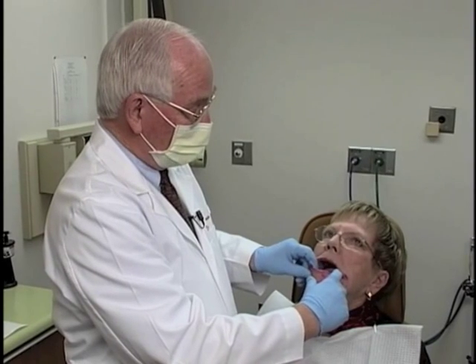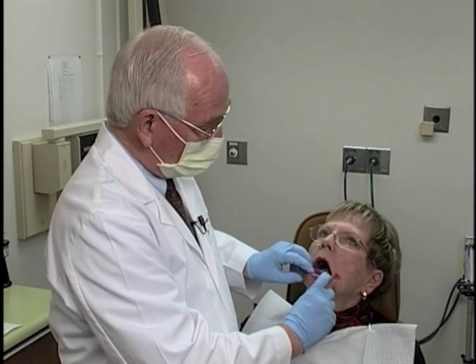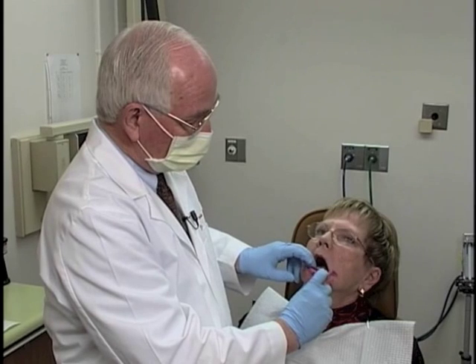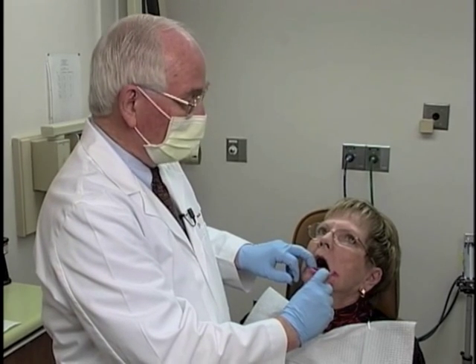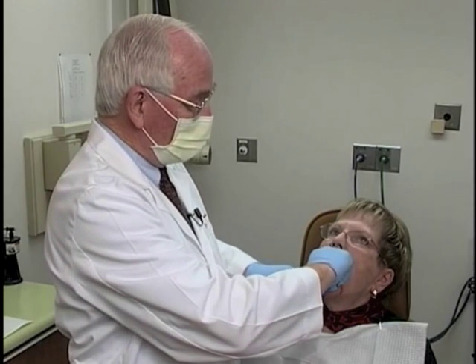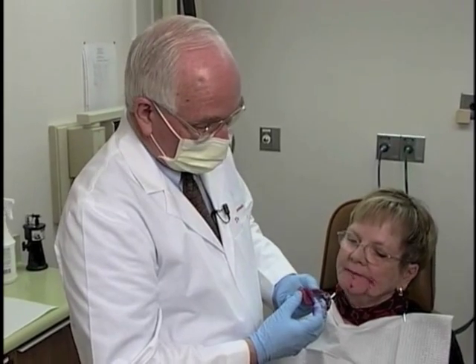Now in order to check to see if the material is totally set, take a fingernail and just poke the material, and if it totally rebounds after you poke the material like that, or put a fingernail print into it, then the material is set sufficiently. You don't need to leave it in there anymore. So we can remove the impression and examine to see what we have.